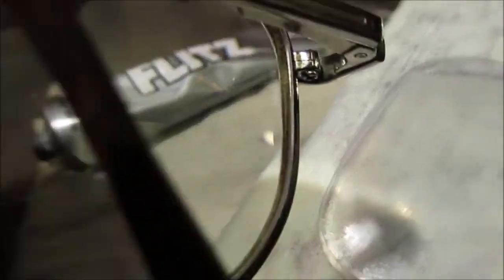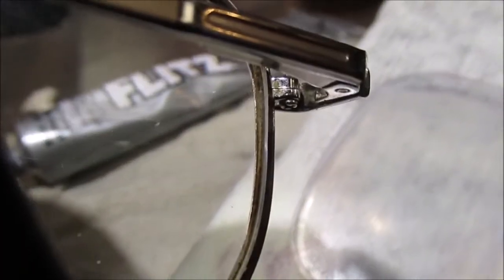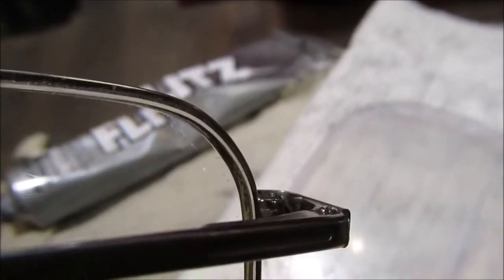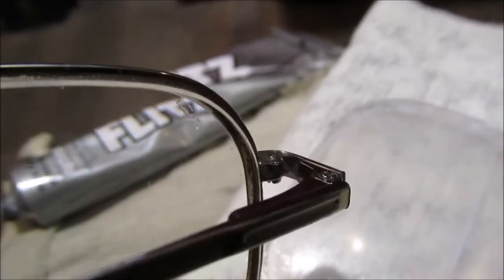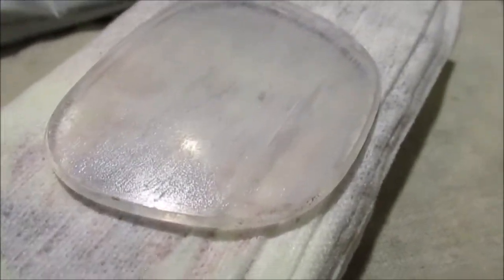That screw has to be all the way tight — I learned that from the eye doctor. If this screw is not tight, the lens is not in there correctly. There should never be a gap in there; that's what holds your lens in. Okay, enough of that — let's see what they look like, we're done.